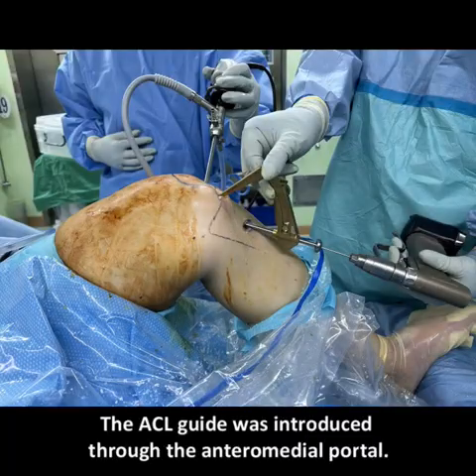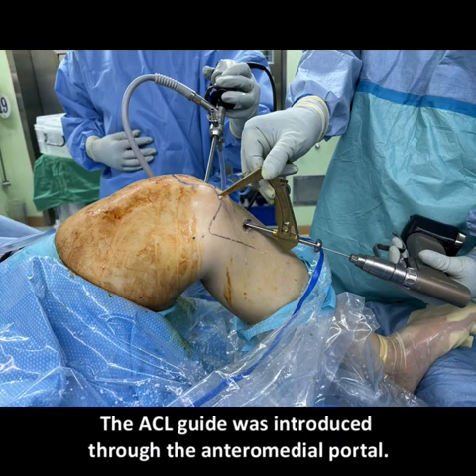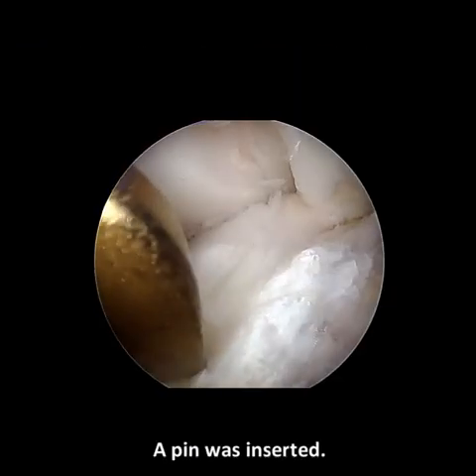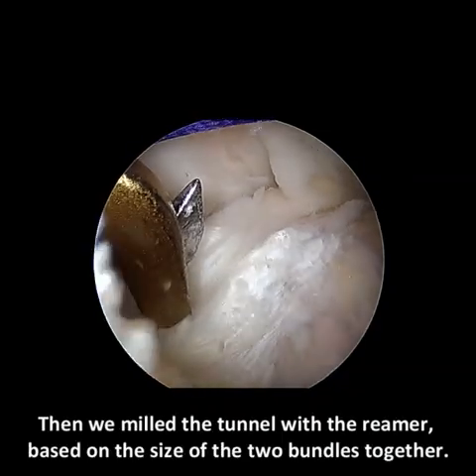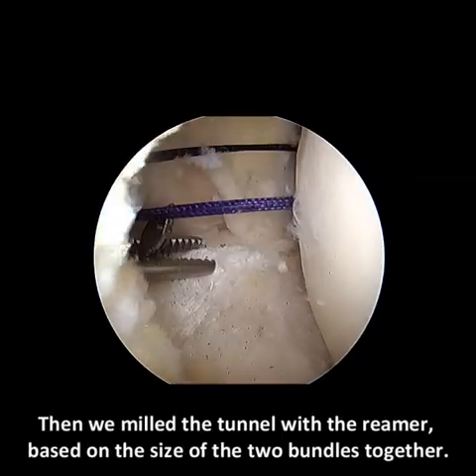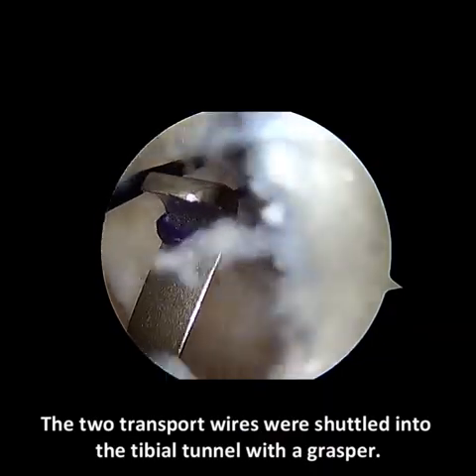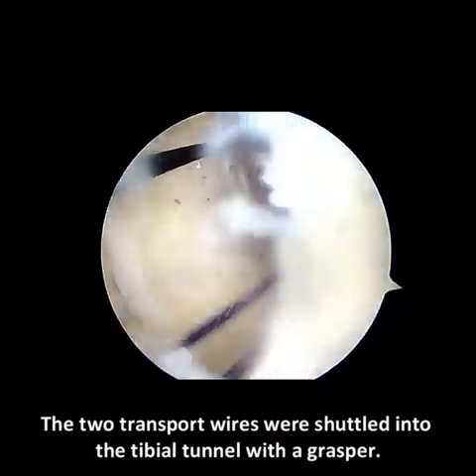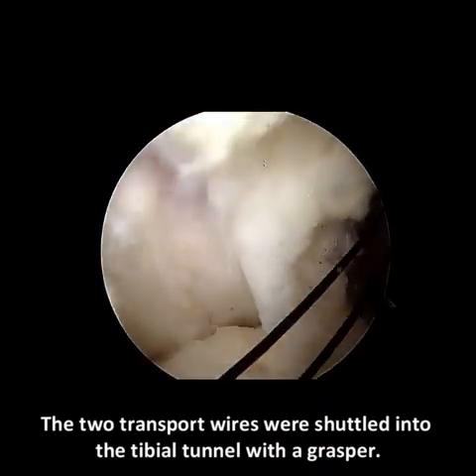The ACL guide was introduced through the anteromedial portal and a pin was inserted. We then milled the tunnel with the reamer based on the size of the two bundles together. The two transport wires were shuttled into the tibial tunnel with a grasper.